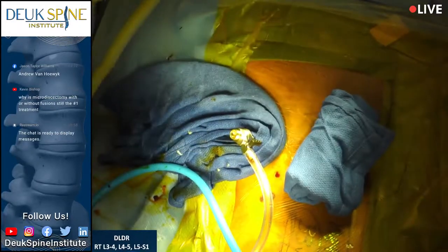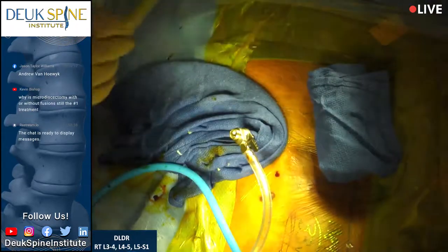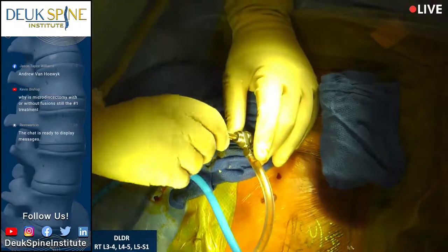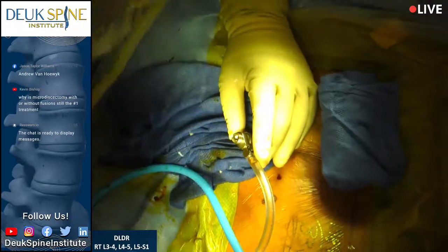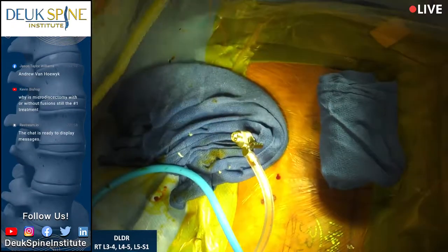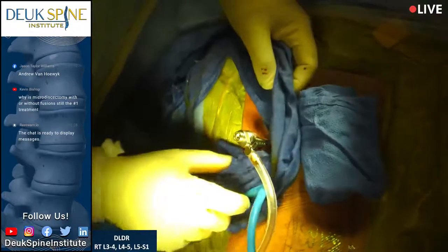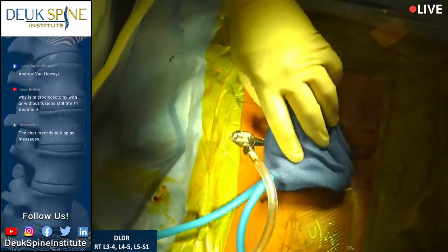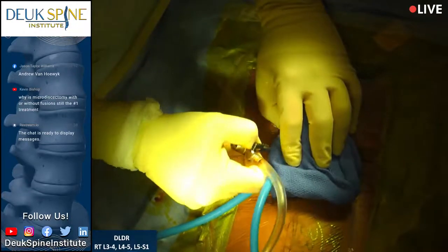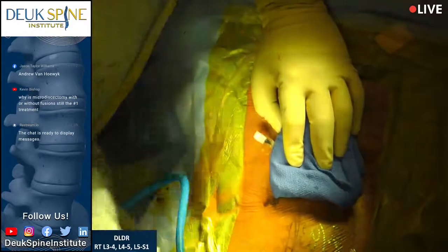And when you put hardware in, I didn't use it yet. I need it now. When you put hardware in, pay attention, man. When you put hardware in, that increases the chance of getting an infection. So because these surgeries don't use any hardware, patients don't have a risk of infection like they do when they're having metal or artificial disc put in. All right, coming out with our tube, we've got one more disc to fix, and then we'll be done.